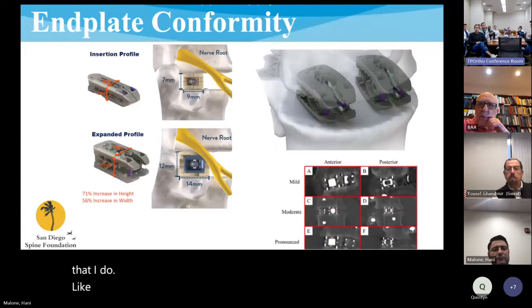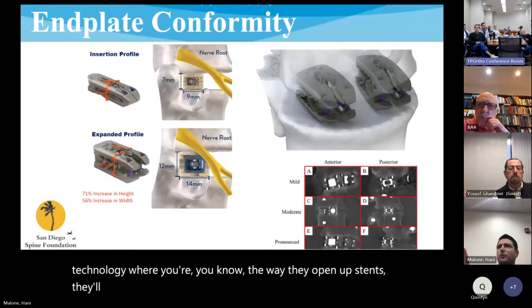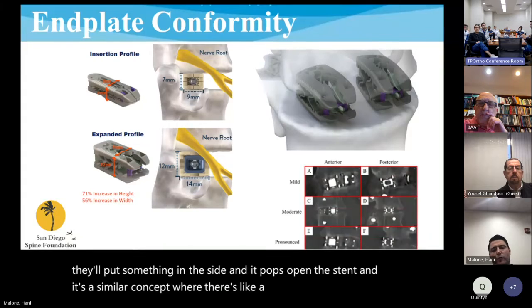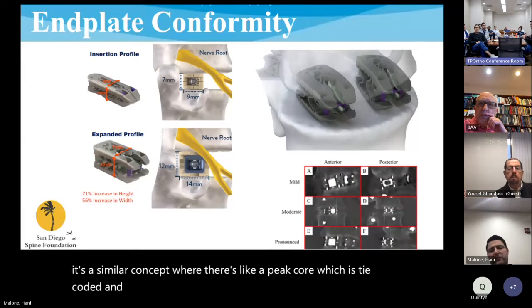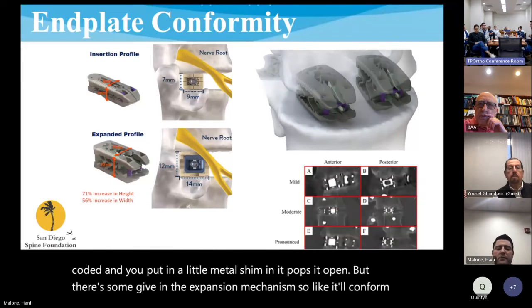This is one that I do like. It's predicated on stent technology, where, the way they open up stents, they put something in the side and it pops the stent open. It's a similar concept where there's a PEEK core, which is titanium coated, and you put in a little metal shim and it pops it open. But there's some give in the expansion mechanism, so it'll conform a little bit to the endplate, which is kind of cool.